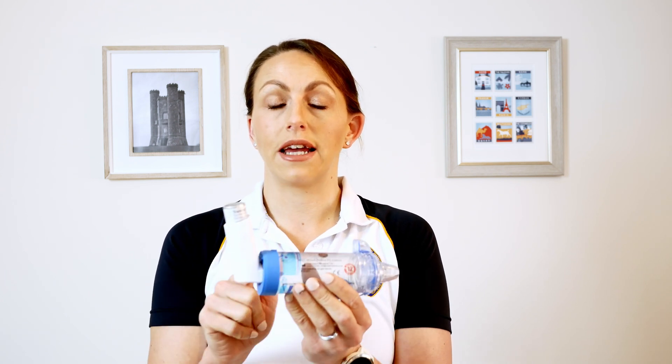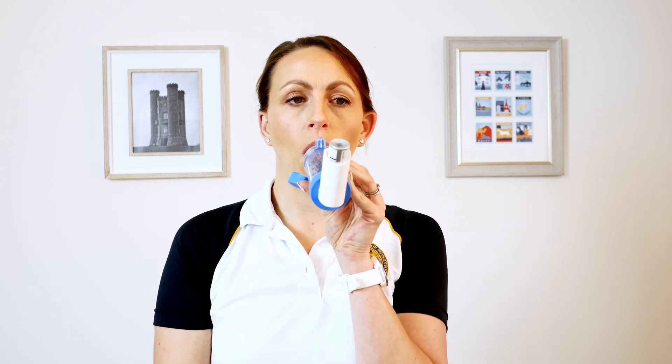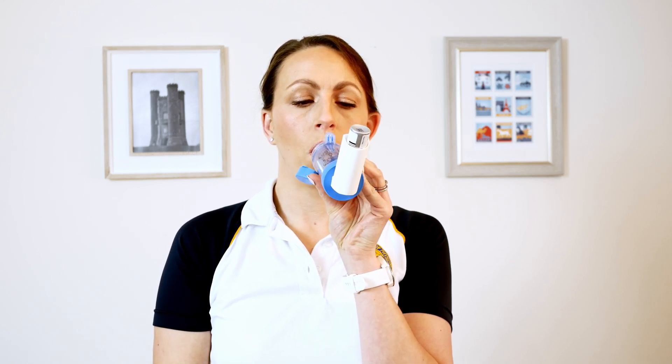Wait 30 seconds after each puff to allow the canister to return to room temperature, making sure it's a gas you're inhaling and not the liquid. So you'll do your shake, press in dose, exhale — or you'll do your shake, pop your dose in and take three breaths. Make sure you finish off by putting all your caps back on everything and you're good to go.